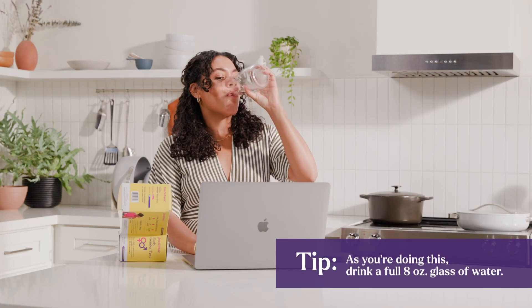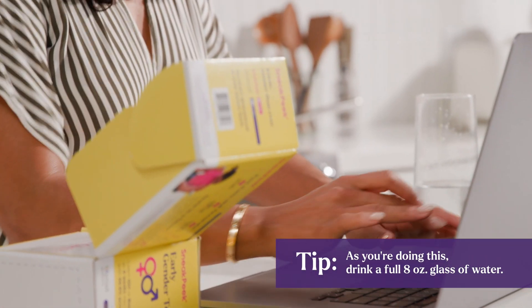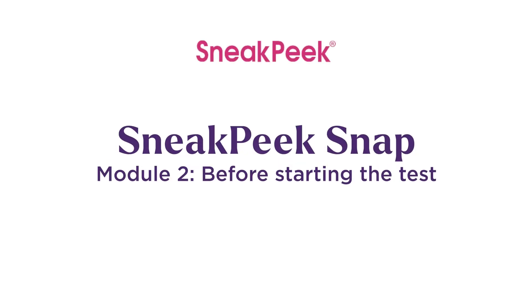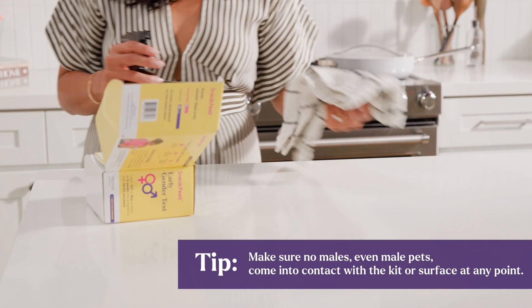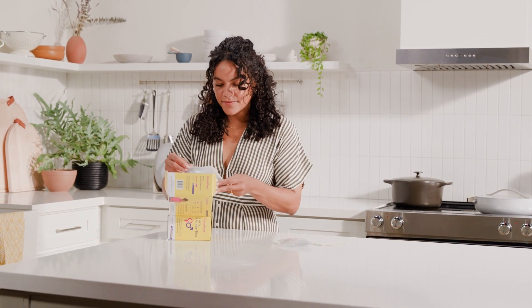As you're doing this, drink a full 8-ounce glass of water. This will help with blood flow and make your sample collection easier. Thoroughly clean a flat counter or table surface with household cleaner or warm soapy water, then place the contents of your kit on the cleaned surface.